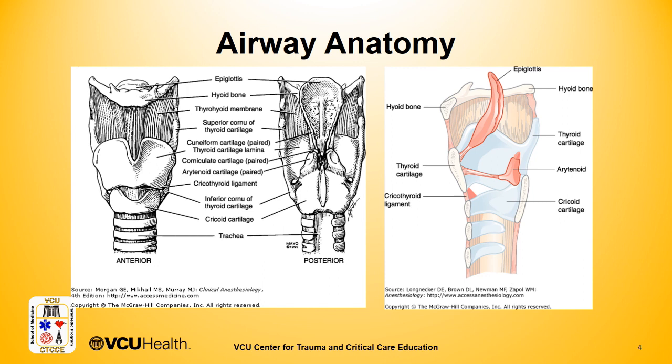So once again, start at the sternal notch, feel up the trachea, then you will have a bump, then a divot, then a bump. The two bumps represent the cricoid cartilage and the thyroid cartilage. The divot in between is the cricothyroid membrane. The divot that you palpate is where your surgical airway is performed.